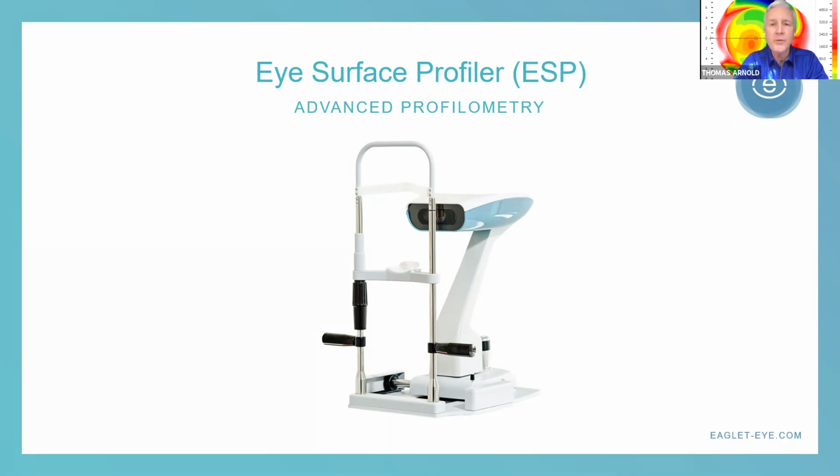So this has been a journey for me because I recognized early on that as we started fitting more and more scleral lens patients, they get more complicated. And as you fit more people, you realize that one size does not fit all. And you can be scratching your head trying to solve a case and not know what's going on. And so profilometry certainly has its place, because that's what we're trying to fit. We're trying to fit the scleral profile. And one of the things I like about the Eaglet is, as you can see from our photo, it's a very small footprint.